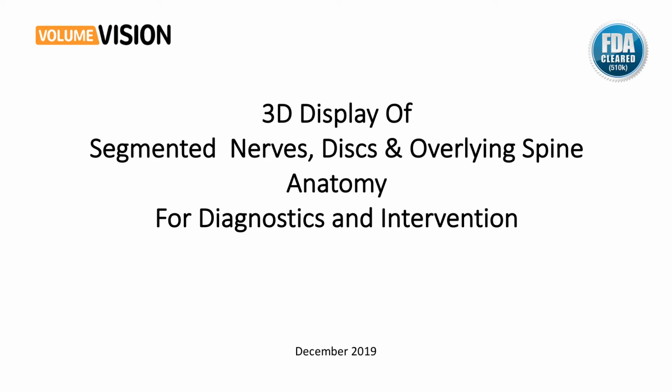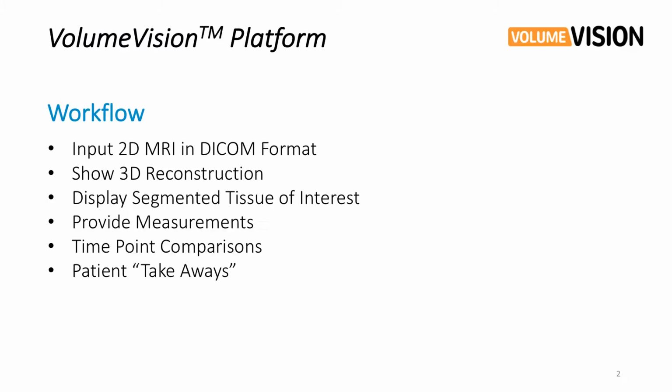This will help Xemina in its clinical trials and support the changes that will happen through the effective use of CARDISTEM, provide confidence to the patients and clinicians, and also give numeric values to the independent investigator trial that will prepare it for publication in a major medical journal.